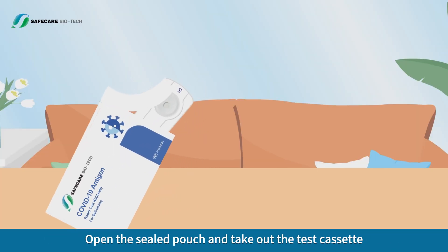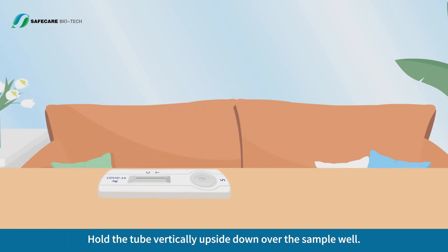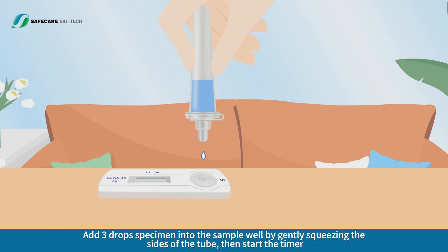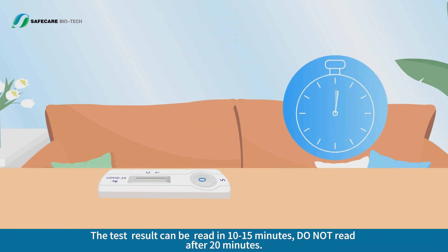Test Procedure. Open the sealed pouch and take out the test cassette. Hold the tube vertically upside down over the sample well. Add 3 drops of specimen into the sample well by gently squeezing the sides of the tube, then start the timer. The test result can be read in 10 to 15 minutes. Do not read after 20 minutes.